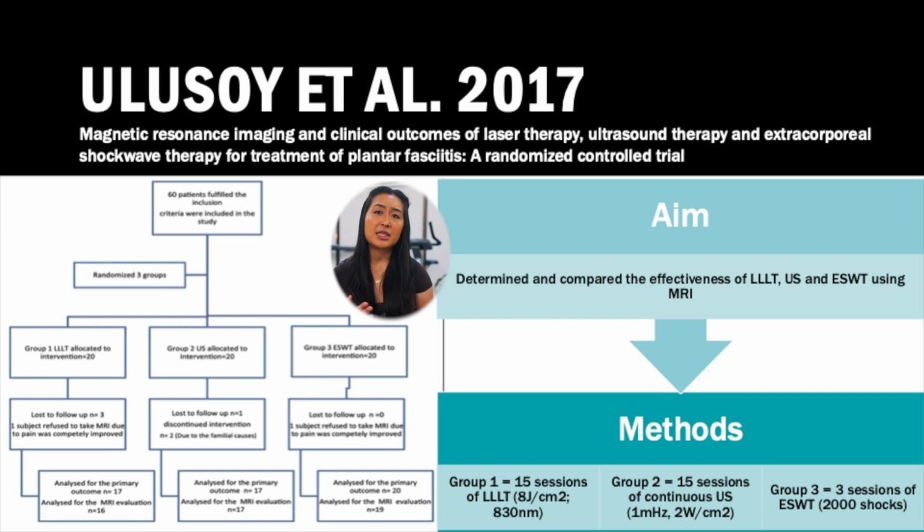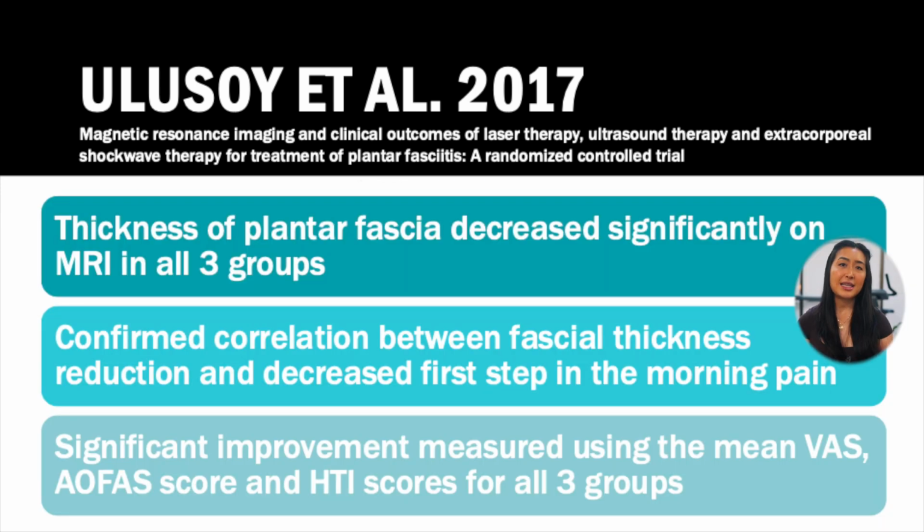Now let's move on to the second study by Ulusoy and colleagues, where they compared laser, shockwave, as well as ultrasound therapy for the treatment of plantar fasciitis. Group 1 received 15 sessions of laser, Group 2 received 15 sessions of ultrasound, and Group 3 received 3 sessions of shockwave. And this study as well followed the dosage recommendations we have spoken about earlier in our presentation. So what did they find?